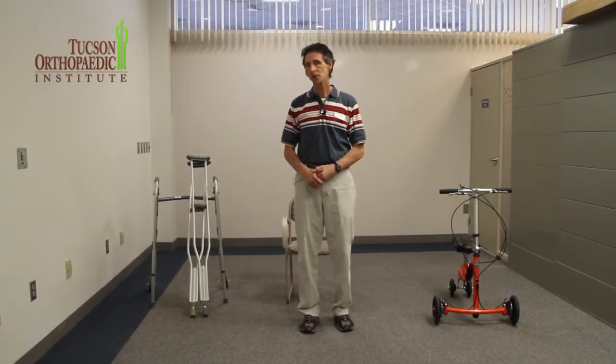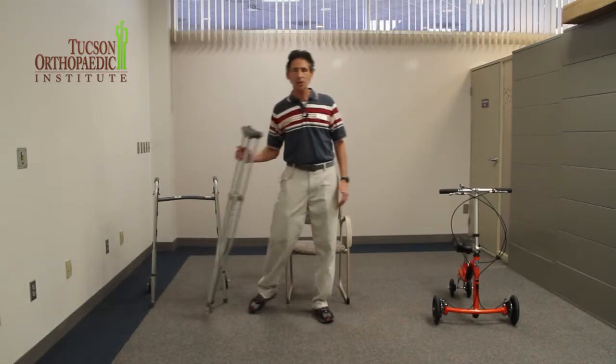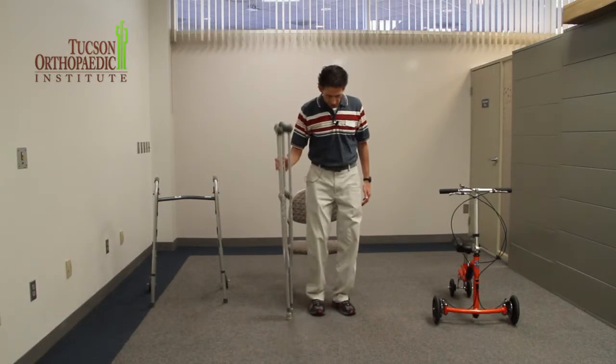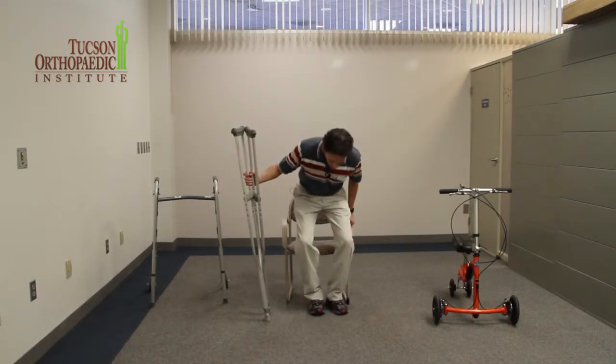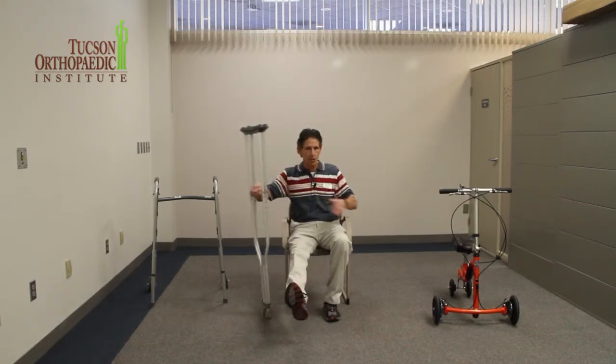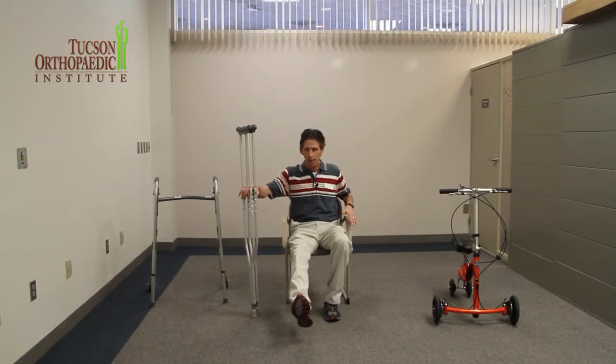What I'm going to show right now is how to use crutches. Crutches take a little bit more coordination compared to a walker. So imagine I'm sitting down in a chair and the doctor does not want me to put any weight on my right leg. To get up from the chair, it's preferable that you have a chair that has arms, because that's going to help you out.